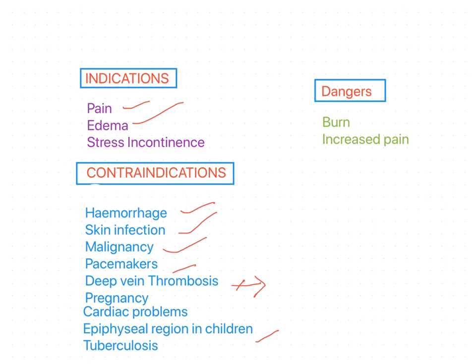So as a rule, the patient is expected to get the sensation of mild tingling type, but if the intensity is too high, or if the electrodes are placed close to each other, or if the bare electrodes touch the skin, the patient may get pain. So both are similarly related, both burns and increased pain. So both will have a common reason.